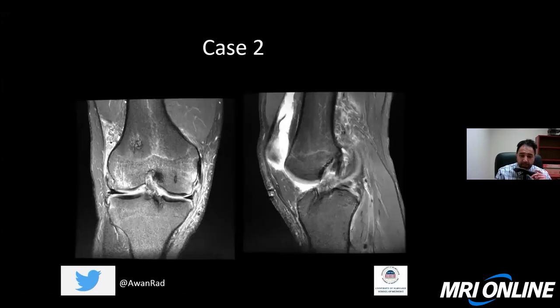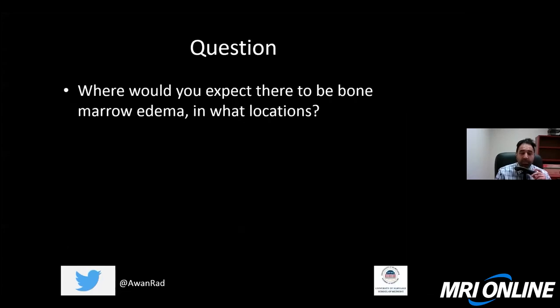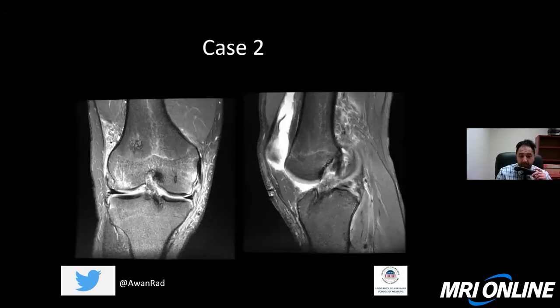Case number two is another image through a patient that's had an ACL reconstruction. You can see the interference screws here. There's an obvious abnormality on the coronal and sagittal T2 fat-sat-weighted images through the knee. The question is: where would you expect there to be bone marrow edema in the knee and in what locations, based on the finding that you're seeing in this patient with status post ACL reconstruction?